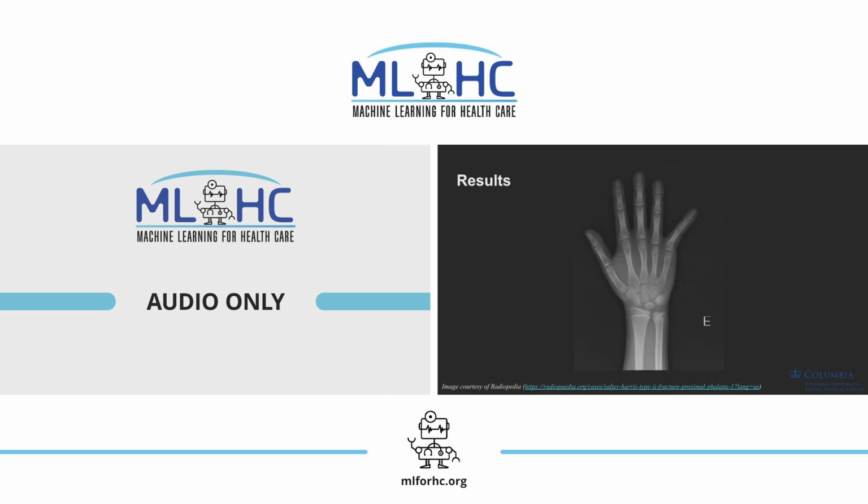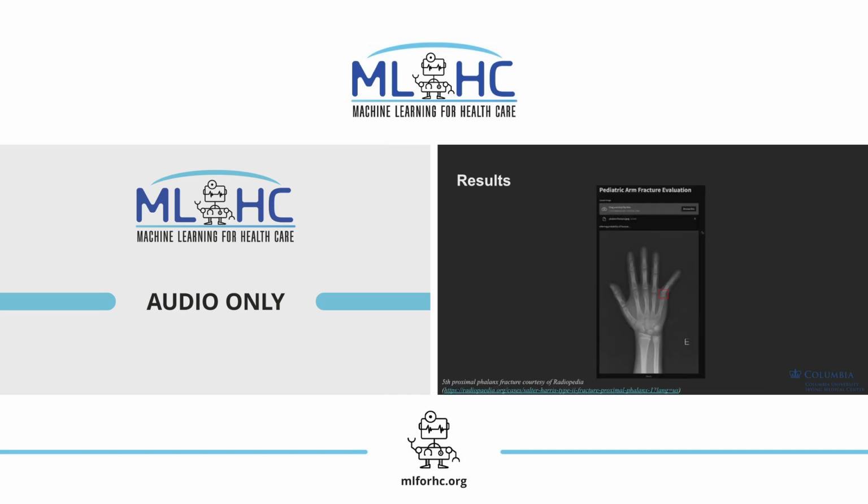Here's an example radiograph of a child's hand from Radiopaedia. We can see that this patient has a fracture of the base of the fifth proximal phalanx. When you upload this image to our web interface, which you can do by either dragging and dropping the image over or taking a picture with your cell phone, it returns a version of the image with bounding boxes drawn by the model. In this case, we can see that the object detection model correctly identified the fracture of the base of the fifth proximal phalanx.